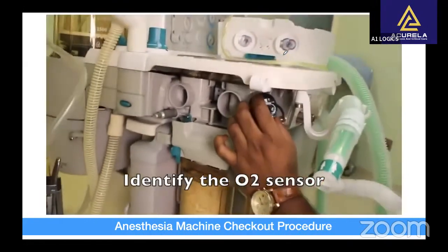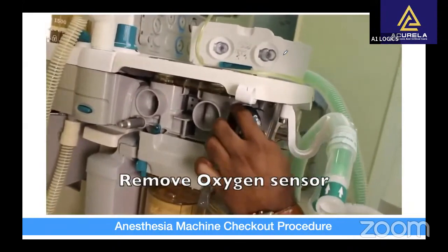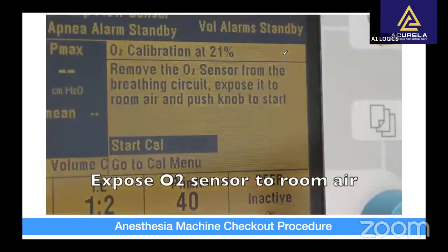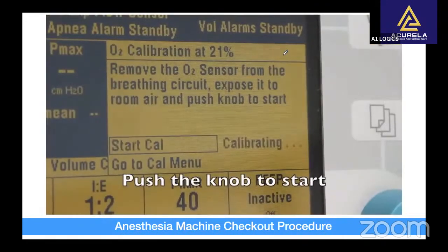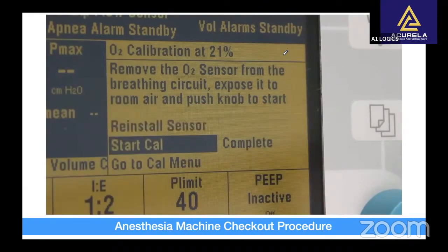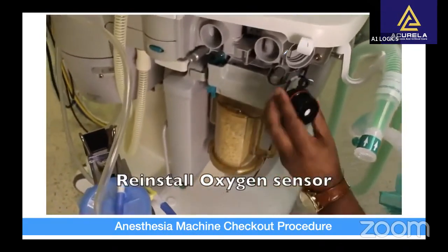Identify the oxygen sensor. Remove it by rotating counterclockwise and expose the sensor to room air. Push the knob to start calibrating. It takes a while to complete the calibration. Once completed, reinstall the sensor, rotate clockwise.